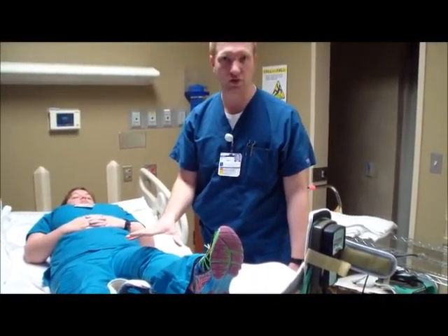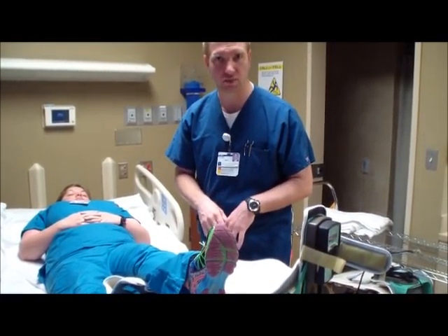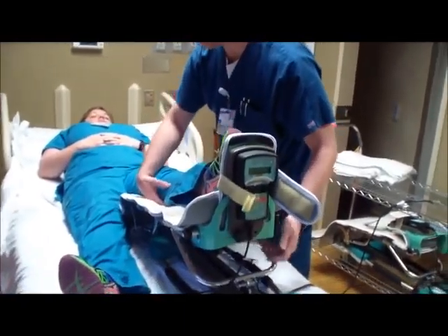The patient's in no danger right here. This just gives me some time to move things around to make sure I get this device in the right position. And keep scooting, scoot the device over.